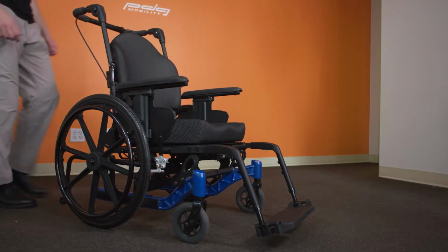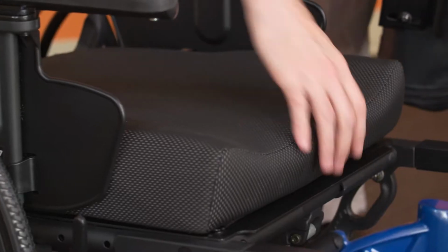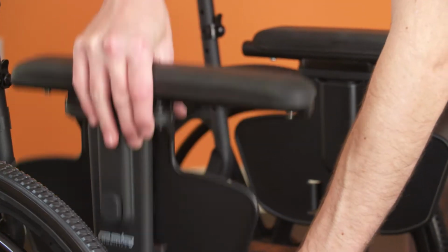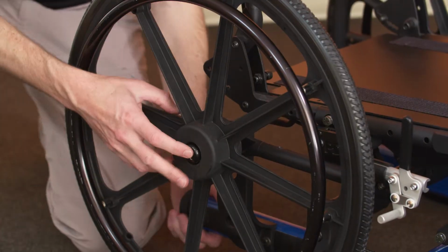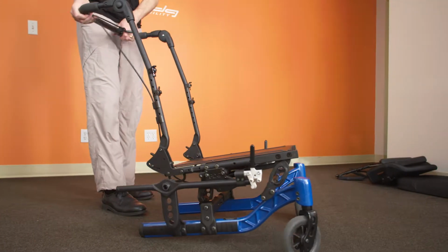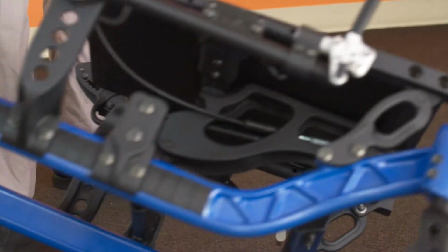Remove all quick release accessories from the chair, including the backrest, cushion, armrest, front rigging, and wheels. Tilt the chair to the most upright or level seating position available. Flip the chair over for better access to the strut mount assembly.